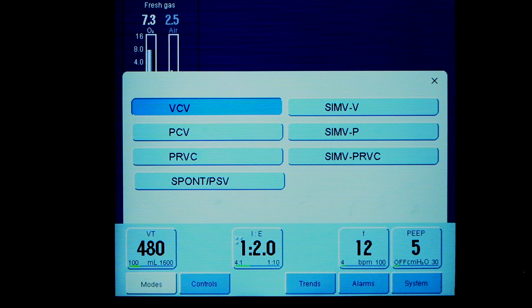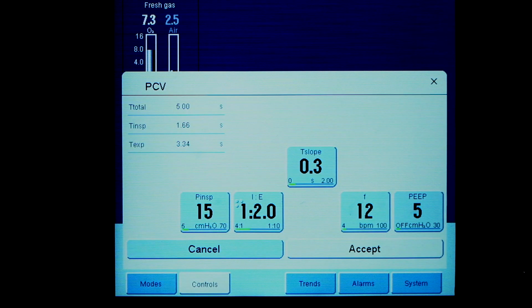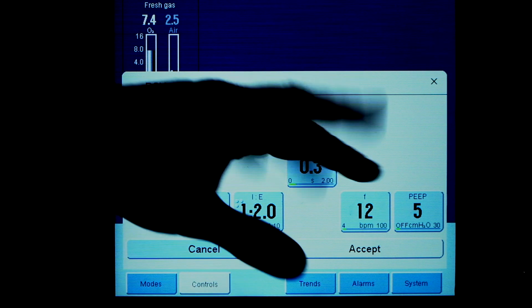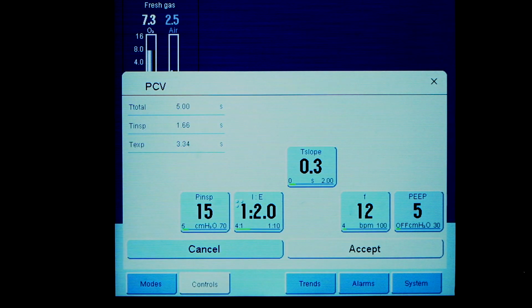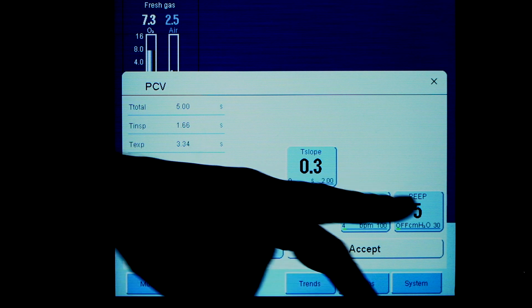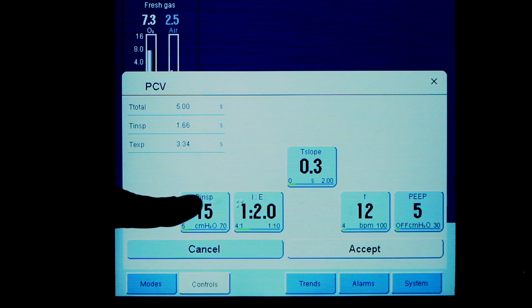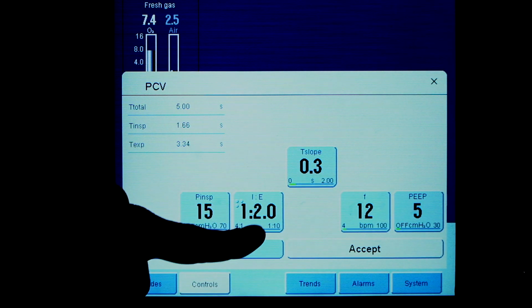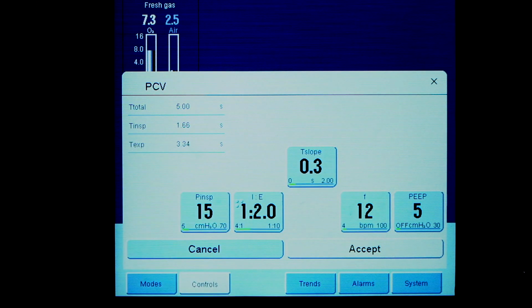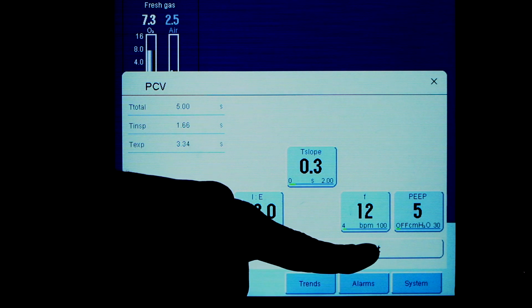Pressure control, you select. Note we've changed the mode and it's given us the control options, but it's also asking us to accept that that's what we want to do. So we can set our P-insp or P-high. P-high, sorry, is P-insp plus PEEP. So this is your P-insp. I to E ratio, frequency, and then slope, which we're going to leave at a default of 0.3. I'm happy with those settings, so I can press accept.